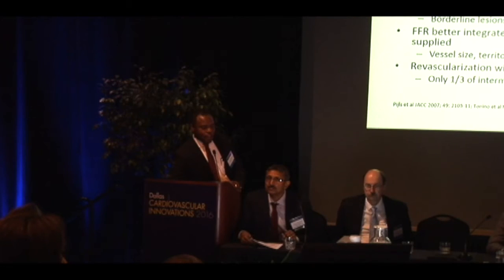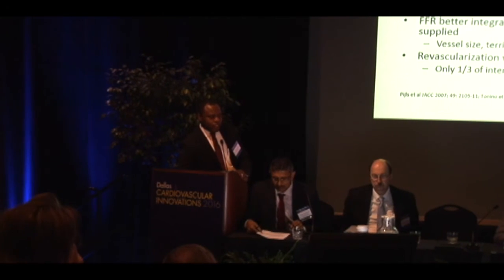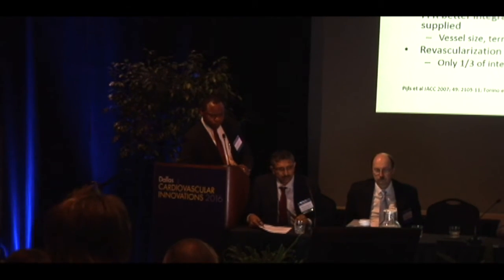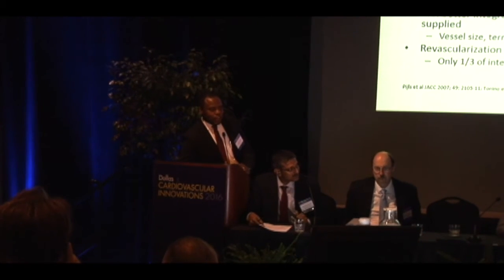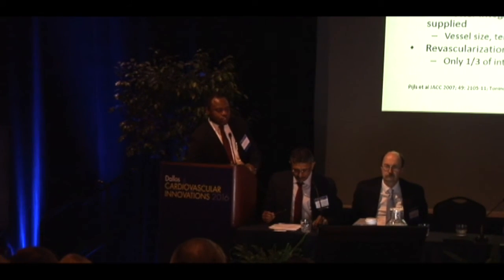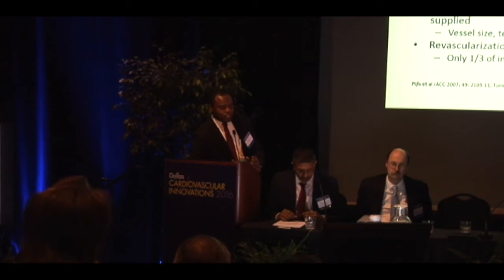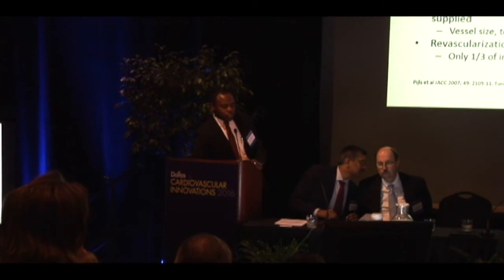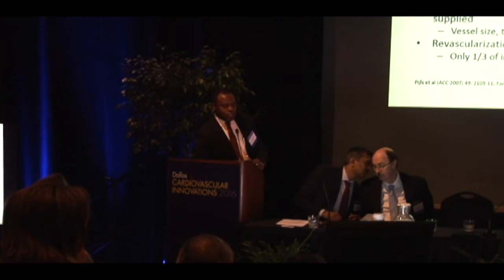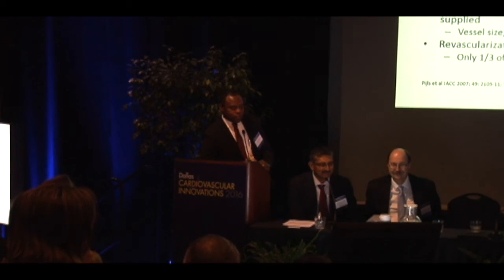Looking for ischemia is a much better correlate than just using symptoms or angina. In addition, a lot of patients enter the cath lab without adequate stress tests, and there are a variety of reasons why that happens. Either the patient cannot undergo an adequate stress test, or it's just inconvenient, or the images are not conclusive. But whatever the case, up to half of our elective patients do come to the cath lab without adequate stress test information. And with the tool of FFR, we can better determine who is ischemic and who will benefit from revascularization.